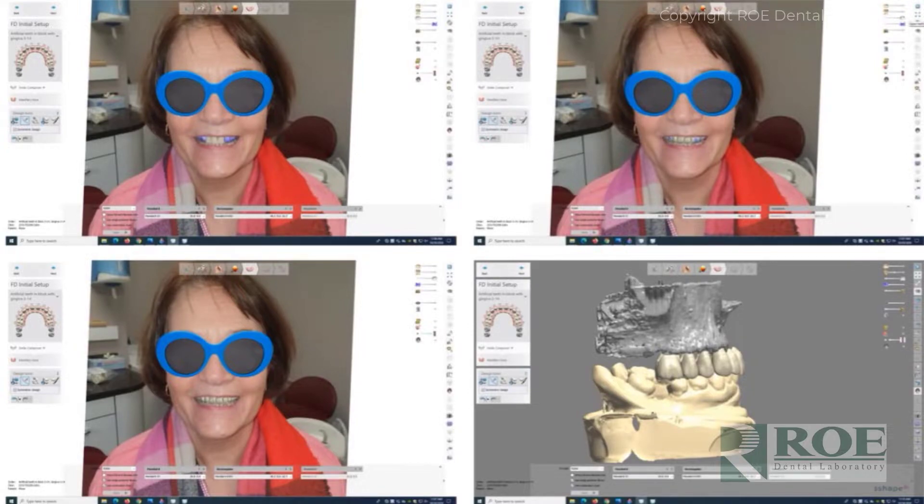From that we imported the files into software to set the teeth, giving a new smile based on the face and based on the patient's soft tissue and hard tissue. As with all of these cases, we do an extensive amount of work before we meet the doctor online: analysis, articulation, bite verification, space verification, and verification of adequate bone for planning as a pre-evaluation.